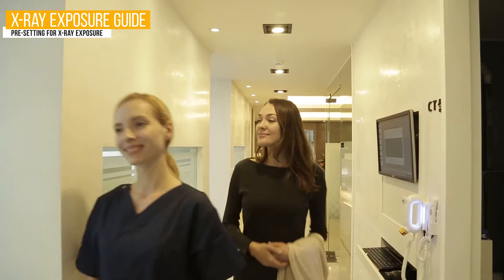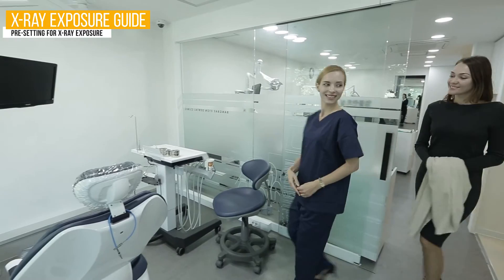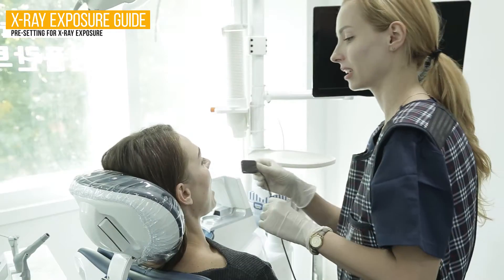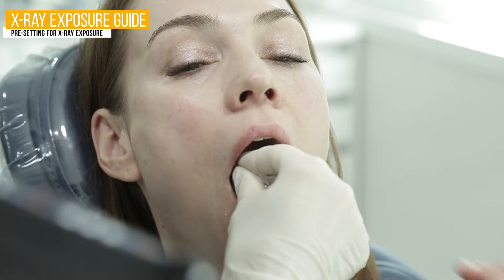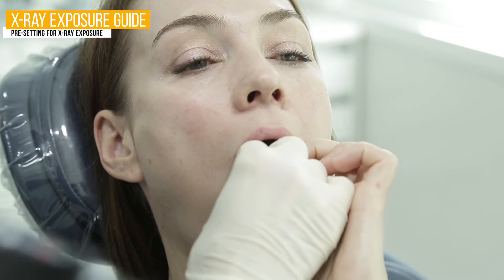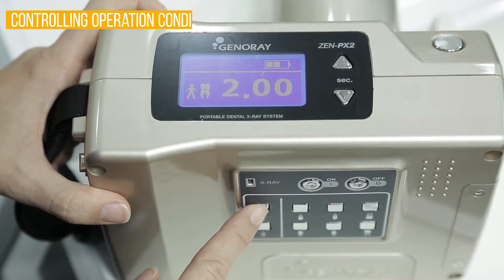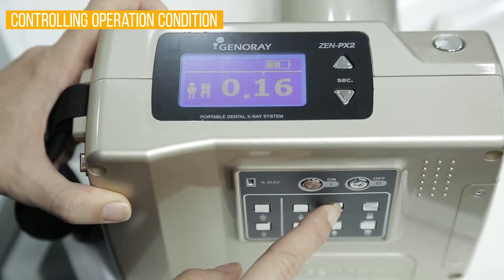Guide patient to exposure area. For safety issues, wear an apron and align the tooth you are planning to expose with the sensor. Set the exposure preset for the tooth you are planning to take, depending on the patient.